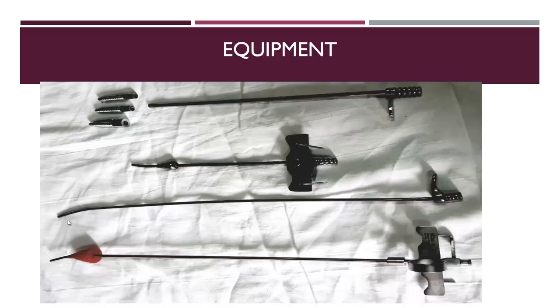The problem is that this thin one can cause extravasation from the cervix during the injection, so take care. Try to choose the one that fits the appearance of the cervix you see. If it is a pinpoint cervix, you can use this one, but if it is a capacious cervix, it is better to use the large caliber corkscrew type.